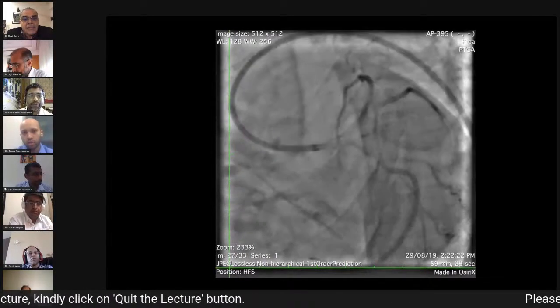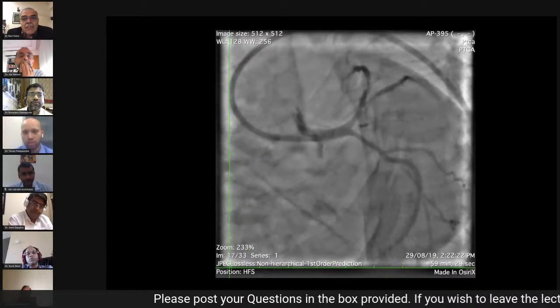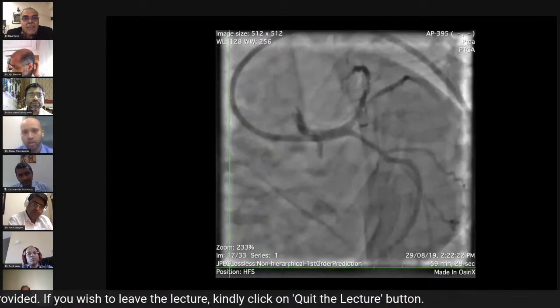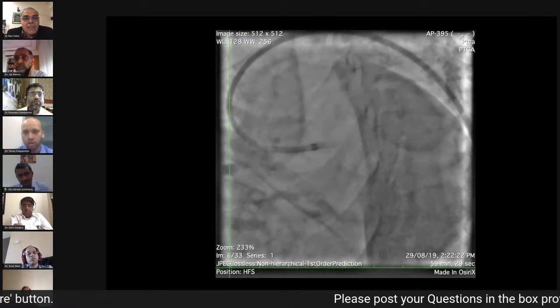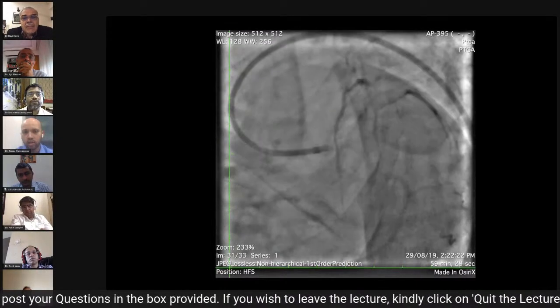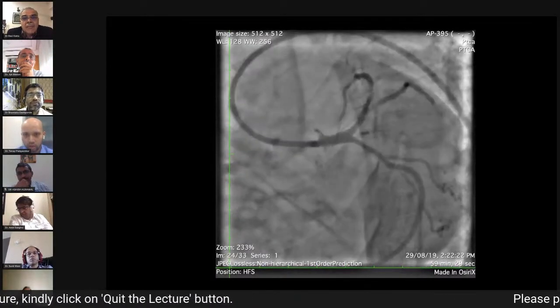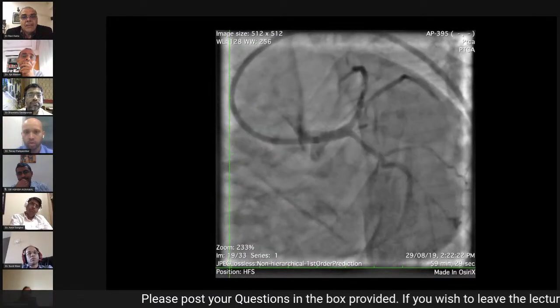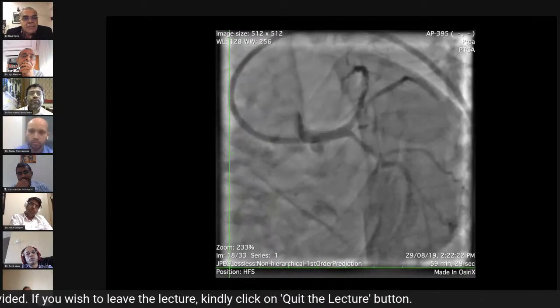What were you thinking? Unfortunately, when I did this almost 6 months back, there was no imaging available. That was out of the question. I was not very comfortable with landing a stent in the plaque around the diagonal, just before or after. So my decision was to go with stenting the LAD from beyond the ostium till the mid segment. Because of the narrow angle at the diagonal ostium, I was quite worried about further plaque shift into the diagonal end. So the decision was taken to go with a dedicated two-stent strategy. Okay, go ahead.